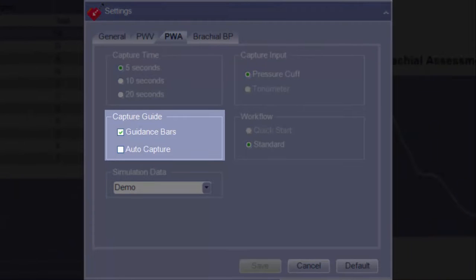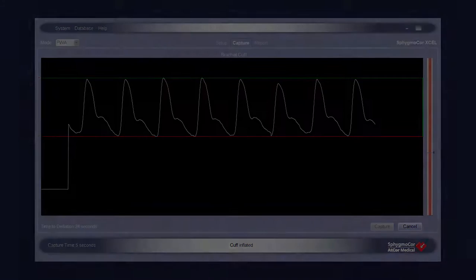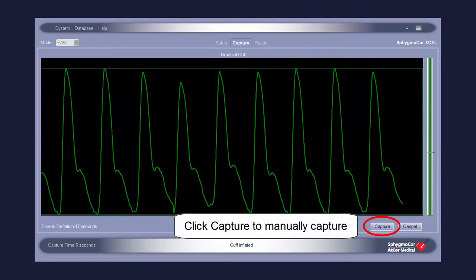Under Capture Guide, the Guidance Bars and Auto Capture options can be disabled or enabled. Guidance Bars provide visual feedback on screen during data capture that inform the operator about the consistency of the waveforms. Auto Capture allows the software to automatically capture waveform data once waveforms of sufficient quality and duration are present. Even when Auto Capture is enabled, waveforms can still be manually captured.